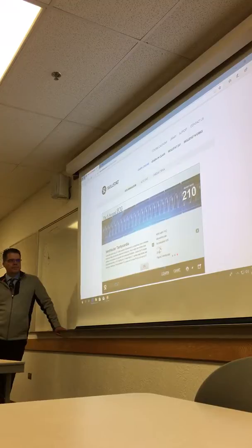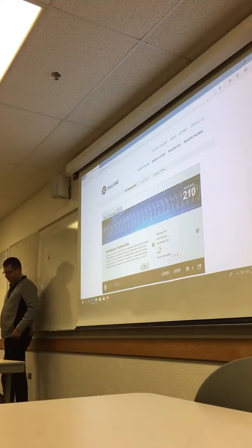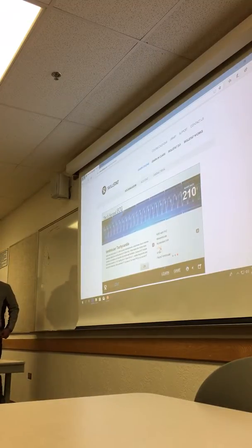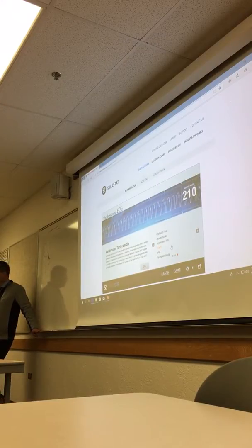Okay, VTAC. You need to know that one, because it needs your immediate attention. What do you think the cardiac output is here? None. It could be very little. And if this is your 80-year-old grandmother, there's going to be very little cardiac output with this. I'd be surprised if there's any.